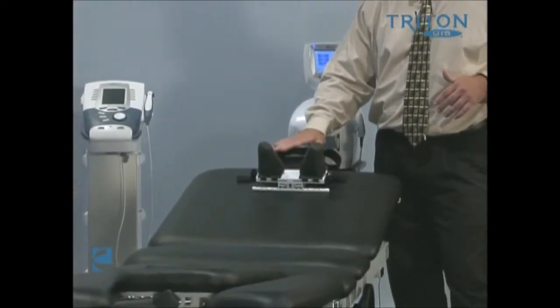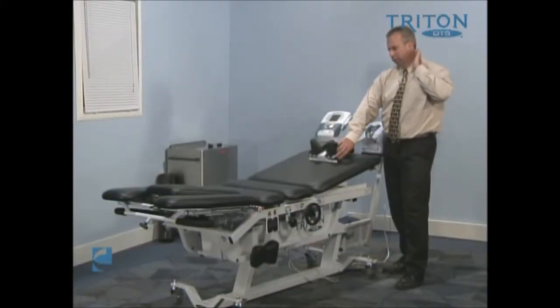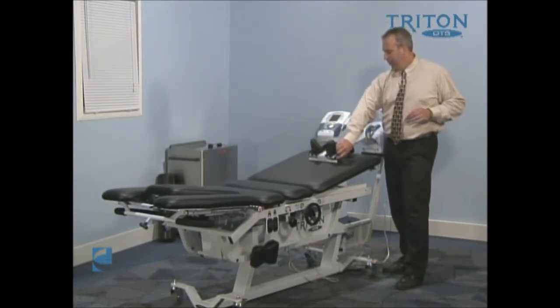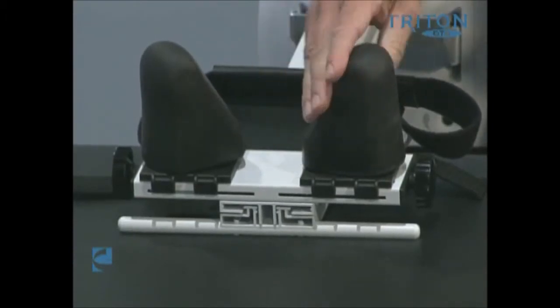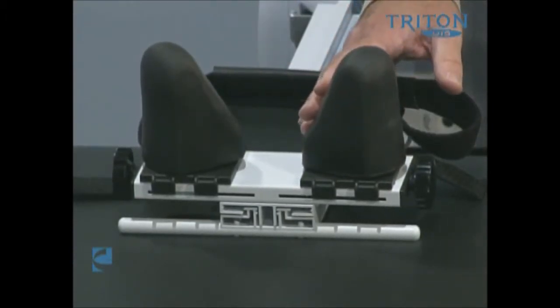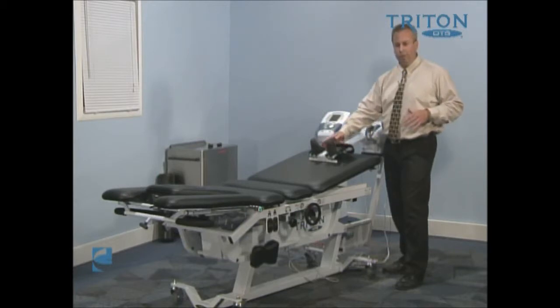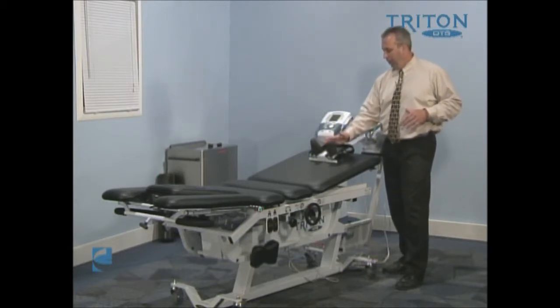A couple things to take into consideration. One is that these pivot, so they will move with the size of the patient as well as our ability to clasp down. We're trying just to grab the base of the occiput behind the mastoid process. When you touch the material, feel that it is a non-skid material. We're not concerned with squeezing the head so tight that we're cutting off any circulation or creating any discomfort. As long as the patient is free of perspiration, it'll decrease any opportunity for it to slide through. The way they're shaped also cradles the base of the occiput, so it minimizes any excess movement.